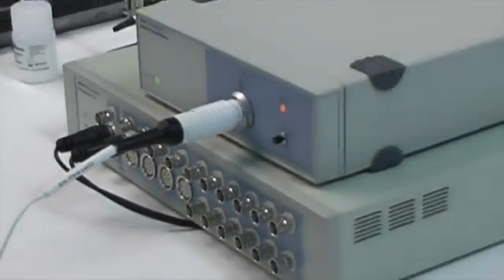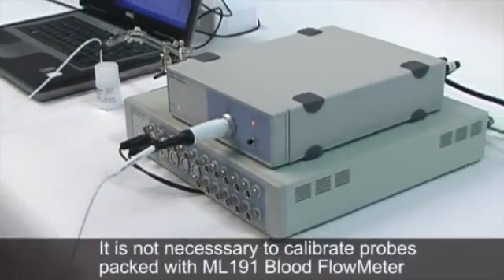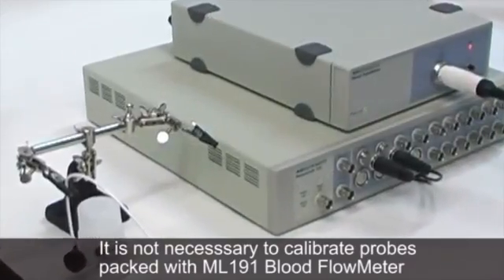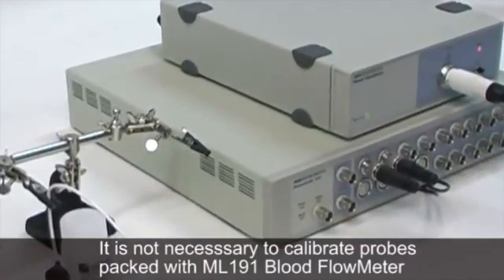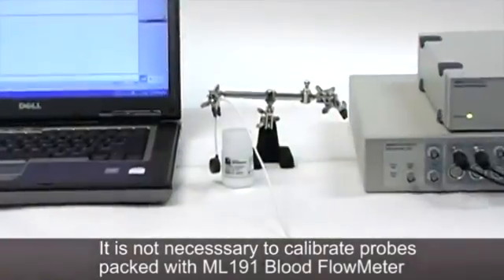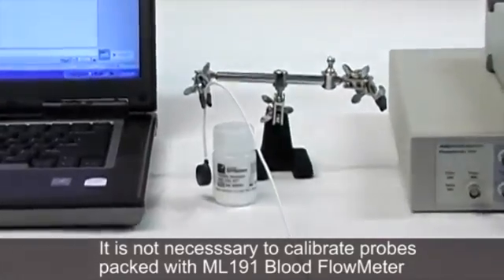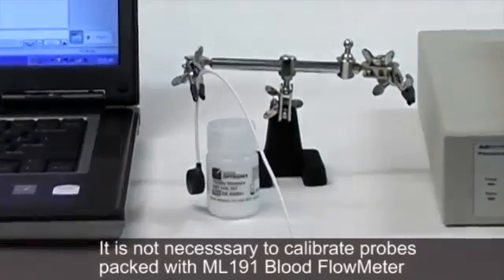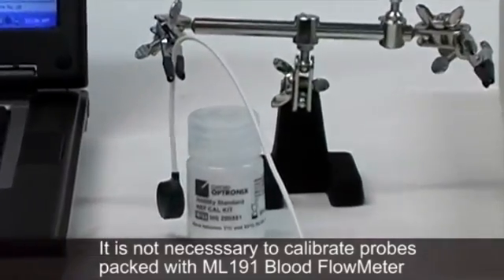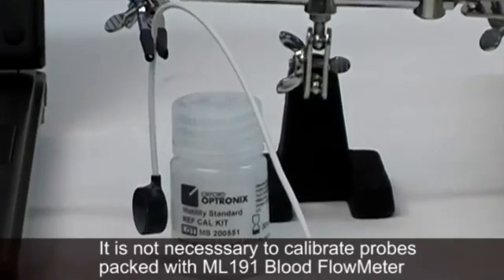Before we begin the calibration, please note that it is not necessary to calibrate probes that were supplied with the ML191 blood flow meter, as these were pre-calibrated at the factory. Any probes that were purchased separately require a calibration.